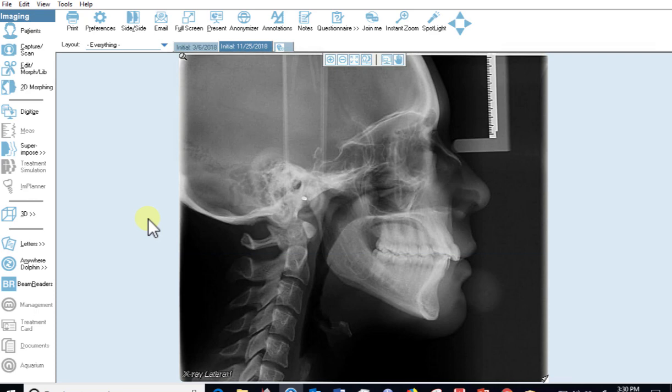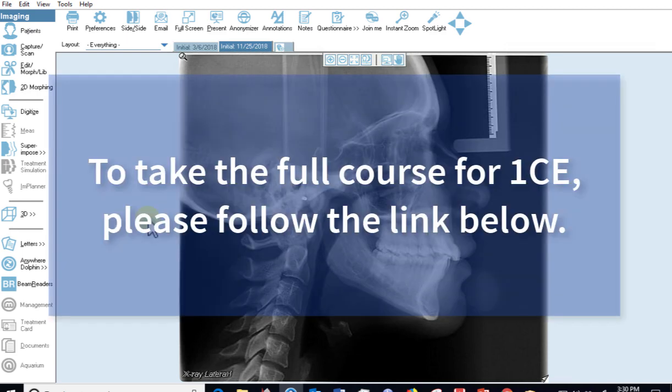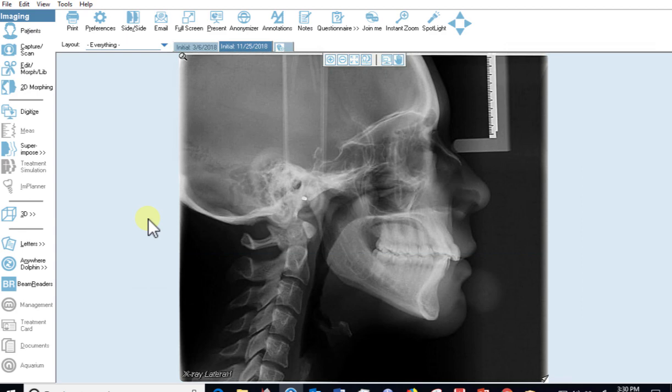Hi, this is Dr. Nagy from the Nagy Orthodontic Academy, and in today's video we are going to talk about cephalometric tracings. This is an important part of your orthodontic diagnosis.